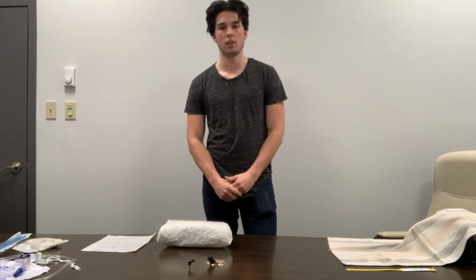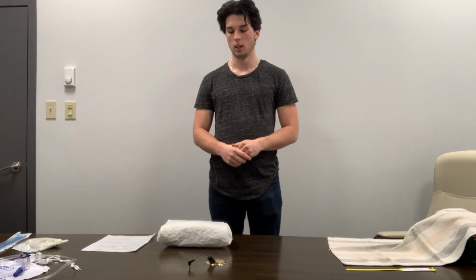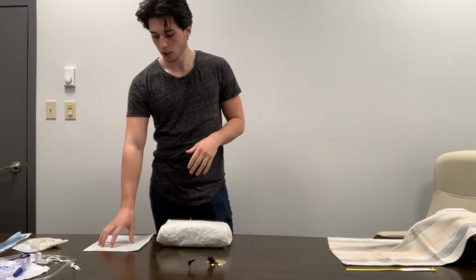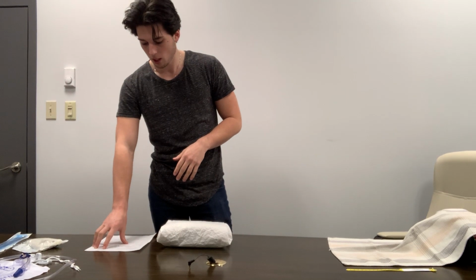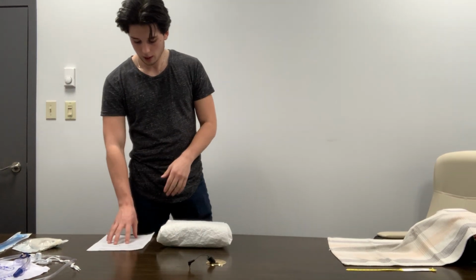Hello, my name is Pharand, and today I'll be demonstrating the insertion and the removal of a Foley catheter. So to start off, we're going to take a look at our physician's orders. So we're going to look at our patient's name, Jake Nursing, and the date of birth, January 1st, 1960. And now we're going to look at the new orders.